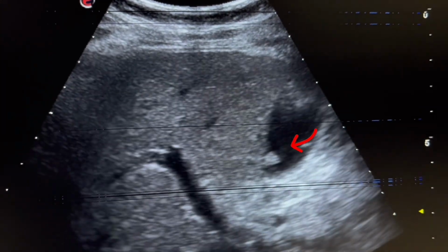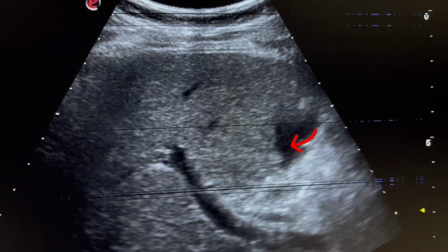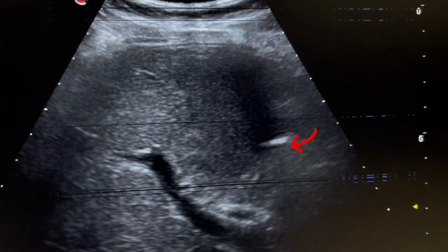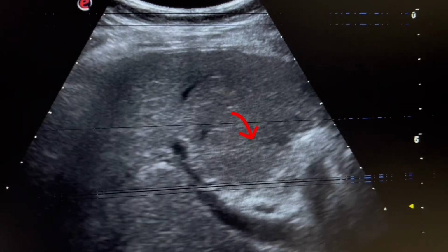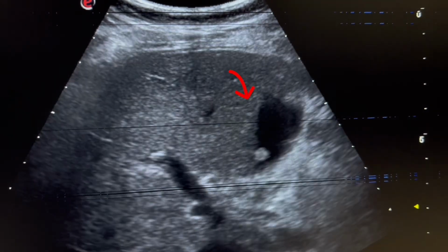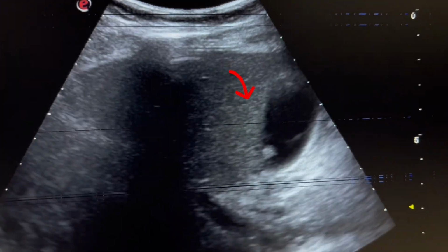And here we see a well-defined echogenic lesion, which resembles a stone. The gallbladder is partially filled and the walls appear to be normal.